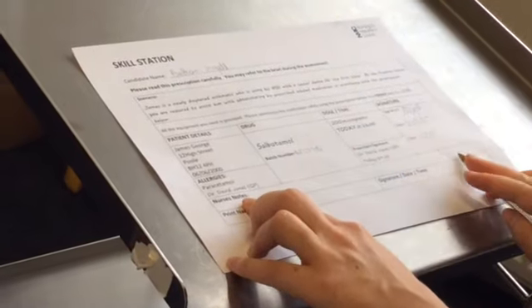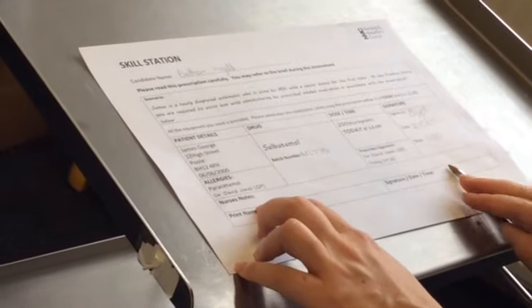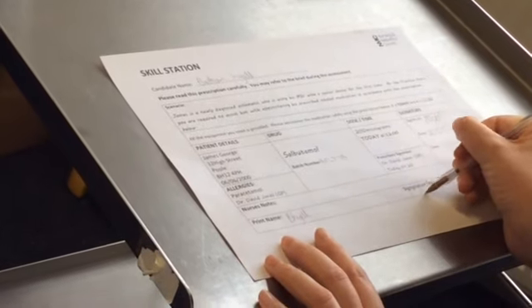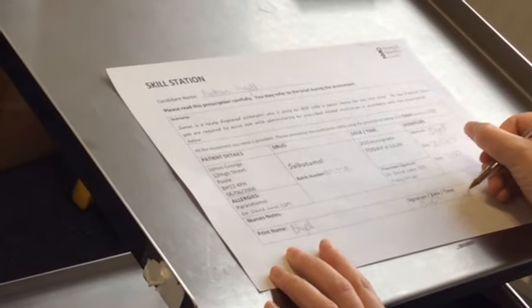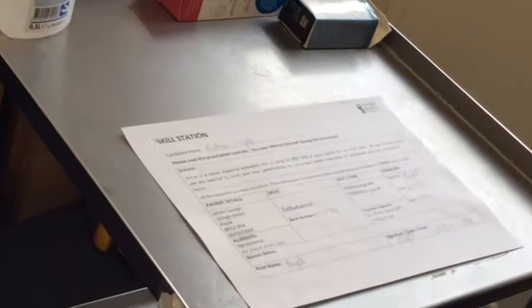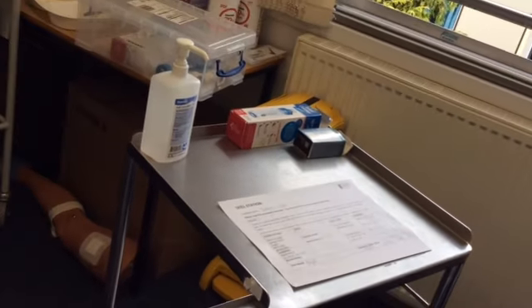Here I can write some nurse's notes, but this isn't necessary for the exam. If you want to write something, you can. And again, sign here with the date and time. So I would now decontaminate my hands, and I'm finished with my station. Thank you.